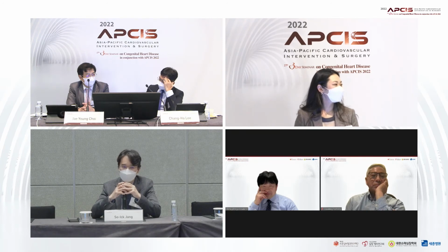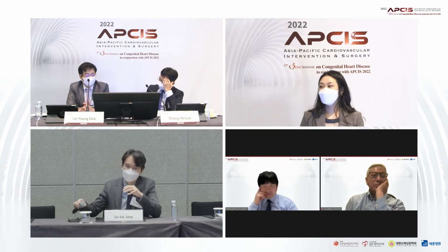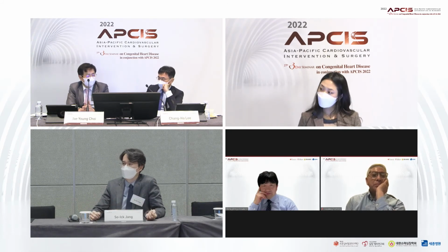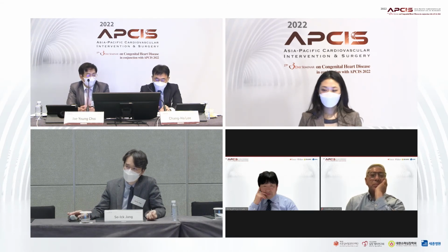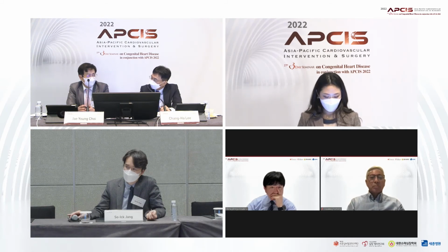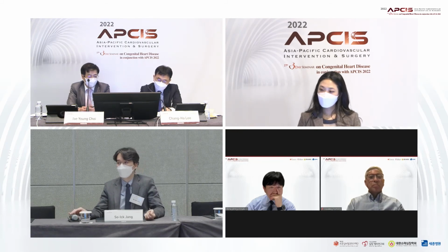Actually, I want kissing. Yeah, kissing is easier, and the tandem stent technique is another option. But we need a large sheath to put both stents in a single sheath, and maybe we don't have such a large long sheath. Also the LPA branch is hypoplastic, so the tandem technique itself doesn't yield enough outcome, I think. So what do you think, Frank?